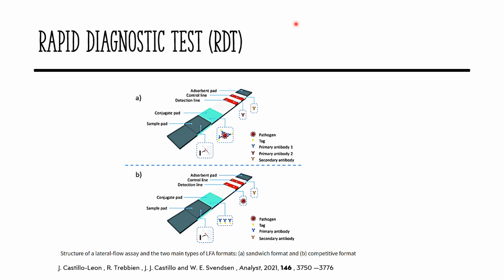A lateral flow assay works similarly to a chromatographic assay, where the components of a liquid sample are transported by capillary action inside a paper-based membrane.